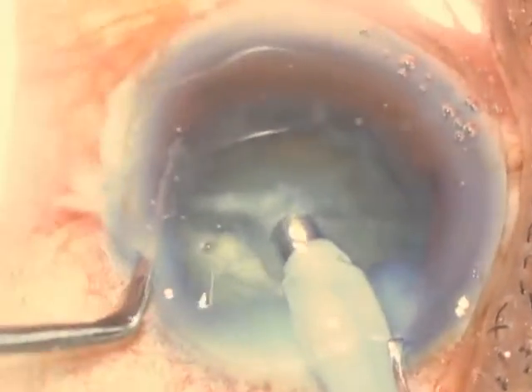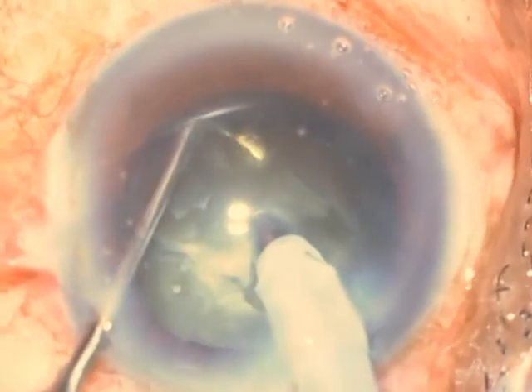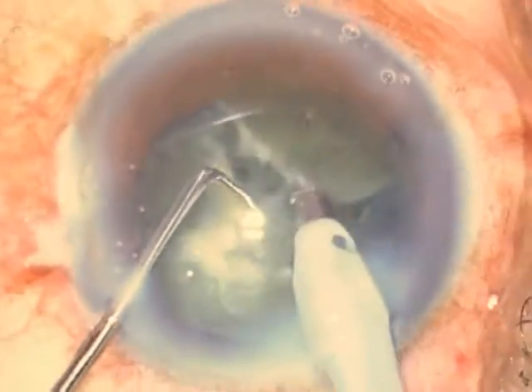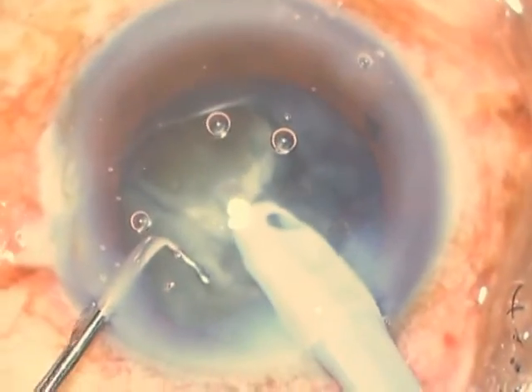Once that is done, I rotate the nucleus to bring the chopped segment downwards or inferiorly, and I repeat the process to chop it into a quarter. Once I've got a quadrant, I emulsify it, which gives me more space in the capsular bag.